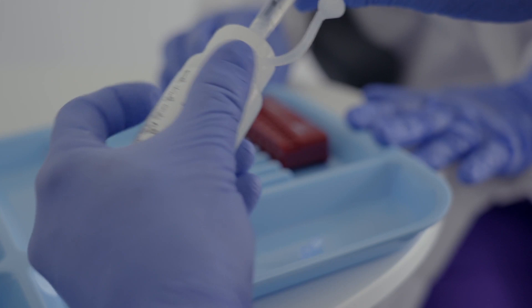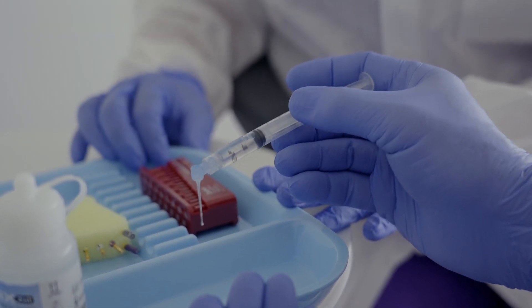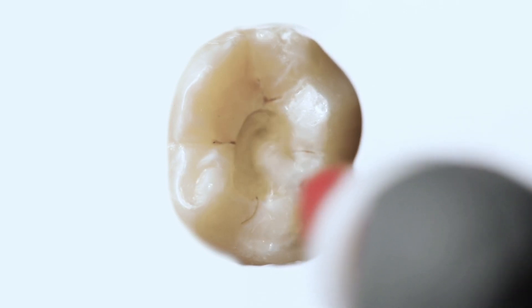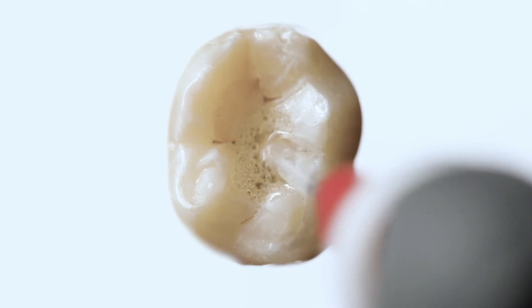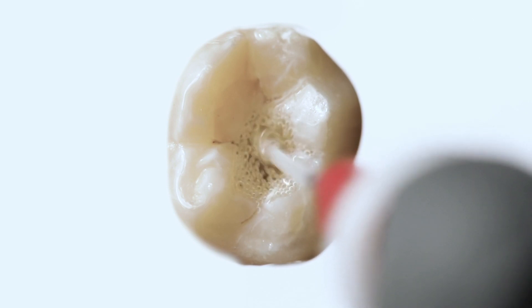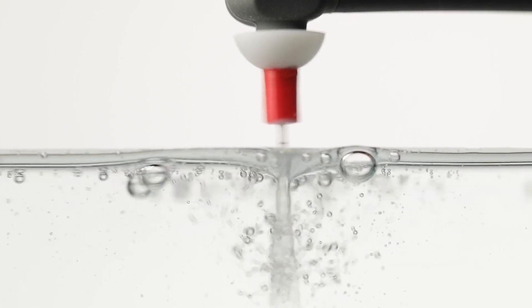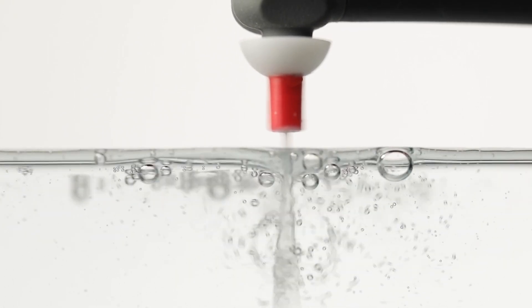When we first started using different fluids inside the canals — primarily bleach as our primary cleaning agent — there was thought that you would allow the bleach to just soak for a period of time, and there was always a discussion of how long was long enough. The activation, where we're soaking or using a needle to push bleach and move it, moves it much more efficiently. Looking through a microscope you can literally see the difference in the cleanliness of the fluids coming out, just loaded with debris. Think of it as turning on your washing machine — it does so much more in 30 seconds than just sitting there soaking.